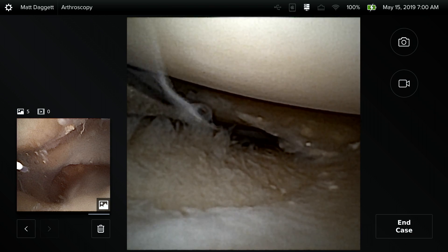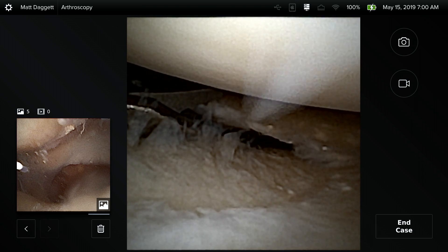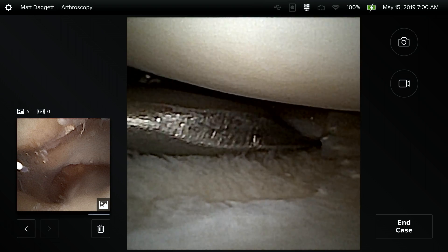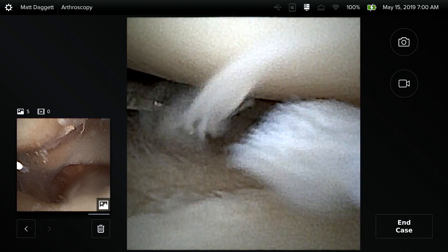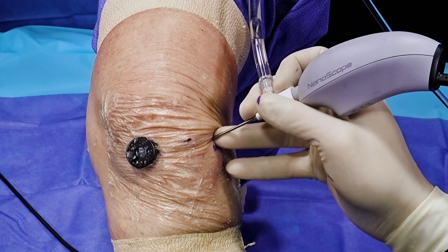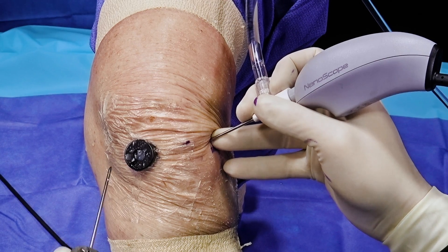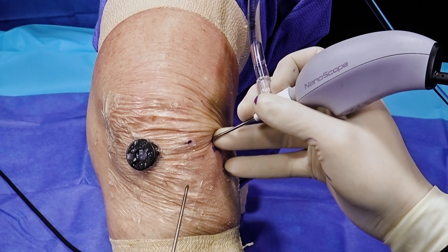The efficiency of this two millimeter biter is surprising. Even though it is quite smaller than standard arthroscopic instrumentation, because of its single-use nature, it is very sharp and efficient. In the same amount of time it would take to do a partial meniscectomy with standard equipment, you can utilize this nano biter without any significant difference. With the cannula in place, we can access inside the knee very efficiently, and once the cannula is in place, we can change instrumentation without causing a lot of damage to the knee itself.